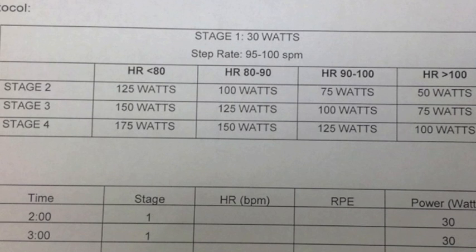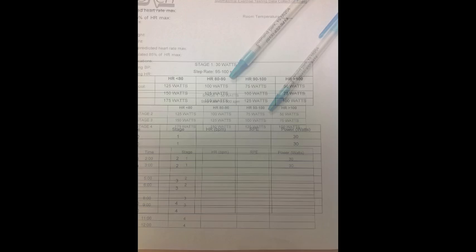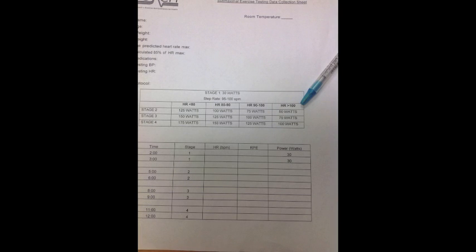Everyone begins the Submax Exercise Test at 30 watts for stage one. As demonstrated in the video, the heart rate response at the end of stage one will determine the subsequent workloads for stages two, three, and four. For example, if somebody's heart rate response at the end of stage one is less than 80 beats per minute, stage two would be 125 watts, stage three 150, and stage four 175. If heart rate is between 80 and 90, stage two would be 100 watts. Heart rate 90 to 100 at the end of stage one means stage two would be 75 watts. And if heart rate is greater than 100 at the end of stage one, the workload would start at 50 watts.